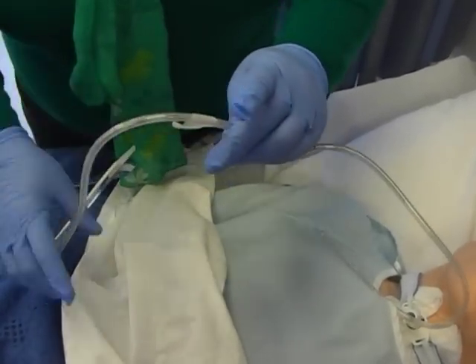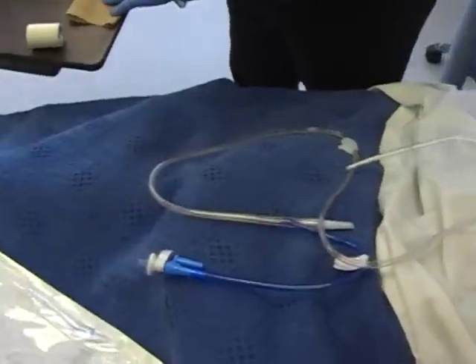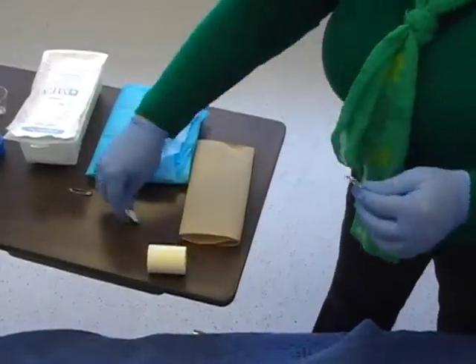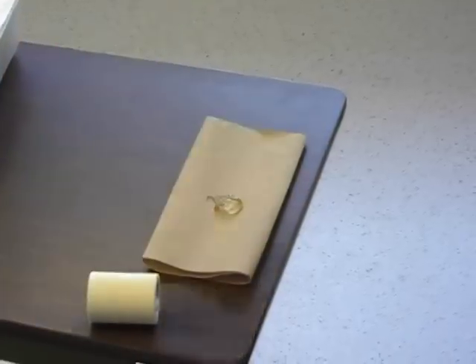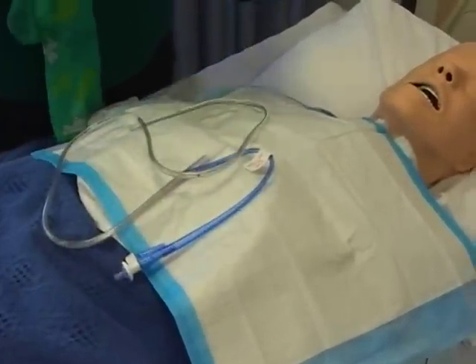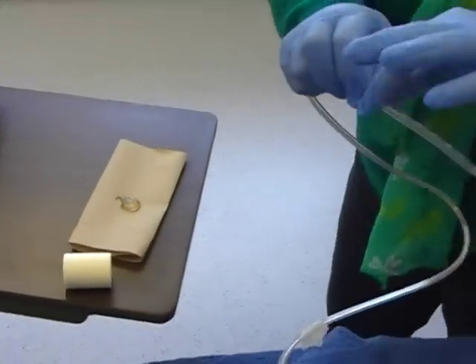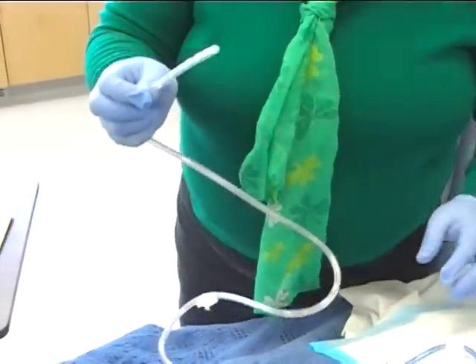Remember, you're inserting this into someone's nose — it's not comfortable. We want to lubricate it as much as possible to make it as comfortable as we can for the patient. Place a chuck pad down to keep the area clean. This is not a sterile procedure — the nose is not sterile. Lubricate the end of the tube all the way, as this will help it pass through the nasal passage.